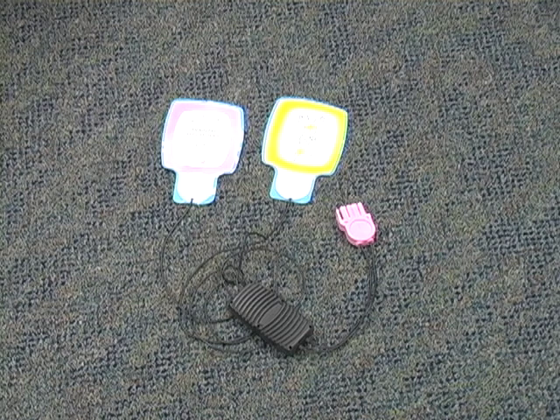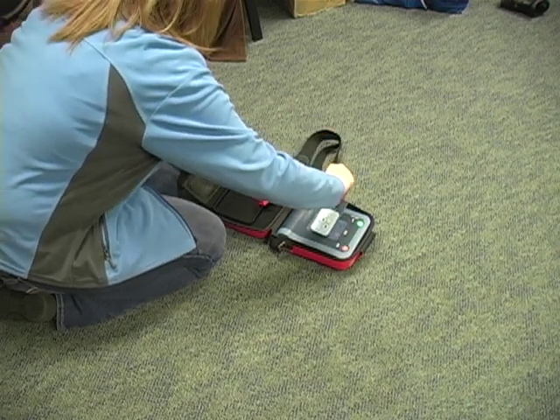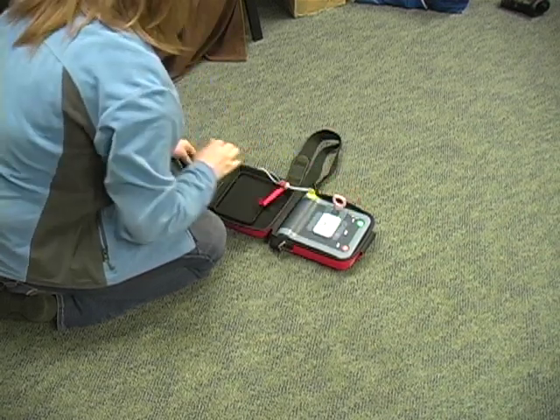Some AEDs in our area carry pediatric patches. If your AED has pediatric patches, you can use them on children and babies. If your AED does not carry pediatric patches, and most AEDs in our area don't, then you can place the patches on the front and the back over the heart. Some AEDs use pediatric reducers and should be utilized on patients less than 8 years of age.